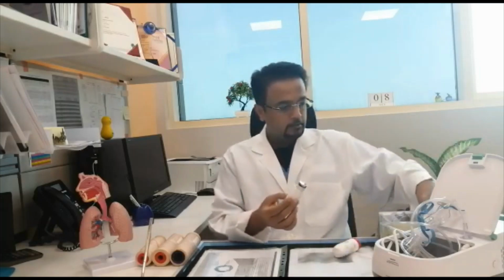So the two main commonly used devices for delivering the medicine are, one, the nebulizer, which is commonly used in UAE, and the second one is the inhalers. They come in different forms, and the device which we use to deliver this medicine is the aero chamber, which comes in two parts. You can wash and dip dry. There is no need to wipe or clean inside. So this goes like this. They come in different forms with the face mask or even just the mouthpiece, which will go in the mouth.